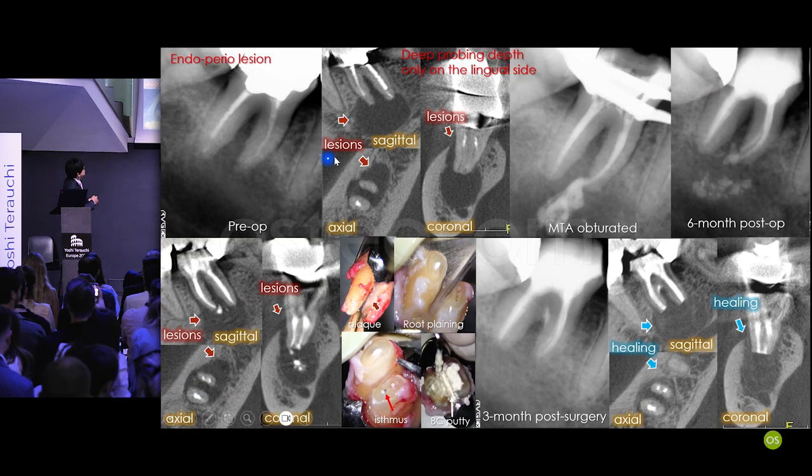Another case, you see a big lesion. I actually retreated, and you see the calculi here. There are several deep probing depths. Then look at the extrusion. This is MTA. I waited 6 months. Most of the MTA is completely gone.